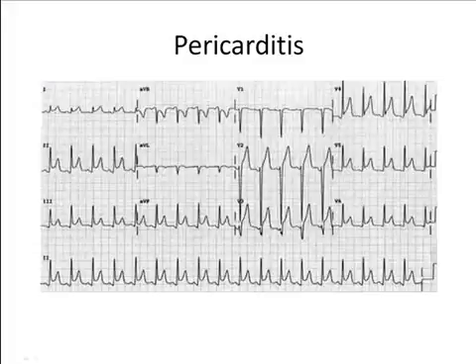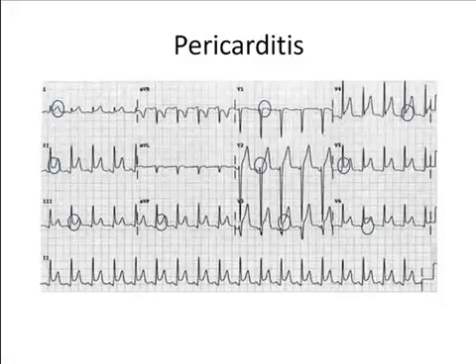At first look, this EKG is alarming. Elevation across numerous leads may trigger you to begin treating the patient with nitrates and aspirin. But upon a closer look, the ST elevation has a concave presentation, almost like it could hold water. A more diagnostic approach is that you notice the elevation widespread across all leads, a trait that is very unlikely in a typical heart attack. Some clinicians will have an easier time recognizing PR segment depression in leads that have the ST elevation. This sign is so suggestive of early onset pericarditis that it is almost considered diagnostic.